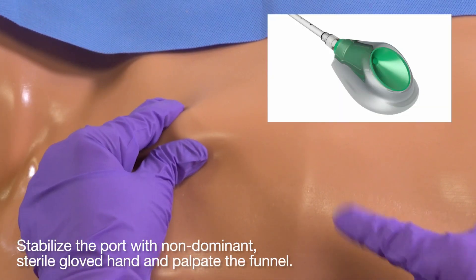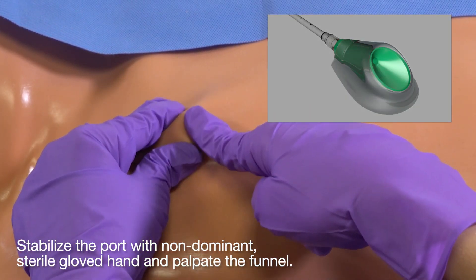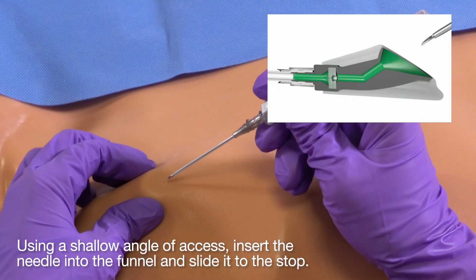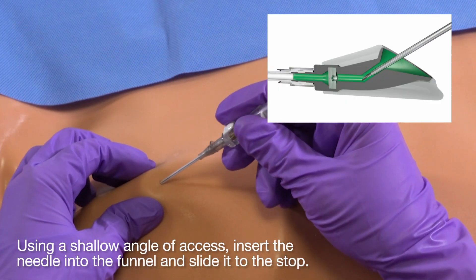Stabilize the port with your non-dominant, sterile gloved hand and palpate the funnel. Using a shallow angle of access, insert the needle into the funnel and slide it to the stop.